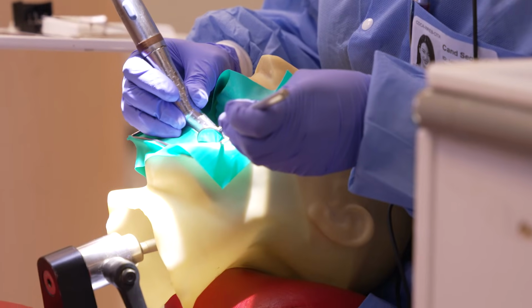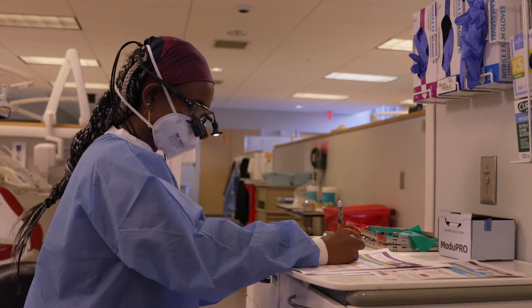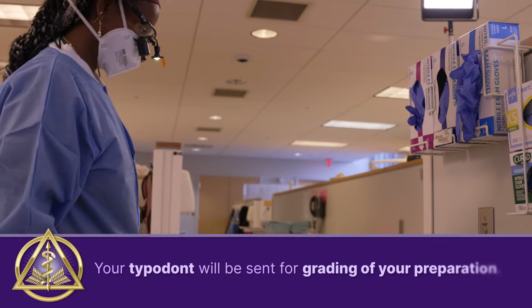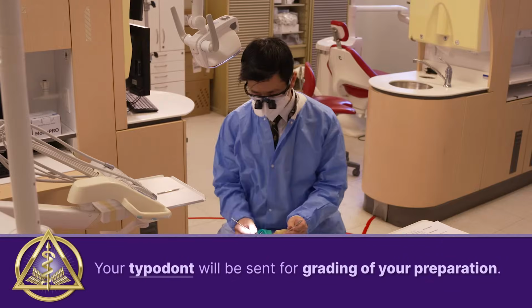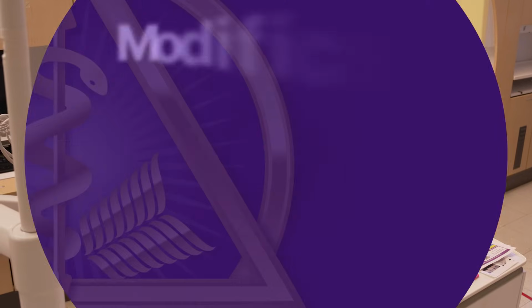Prepare the tooth to acceptable dimensions. If the tooth needs no other modifications, call over a CFE to review your paperwork. Your typodont will be sent for grading of your preparation. Your preparation will be evaluated by 3 calibrated examiners.